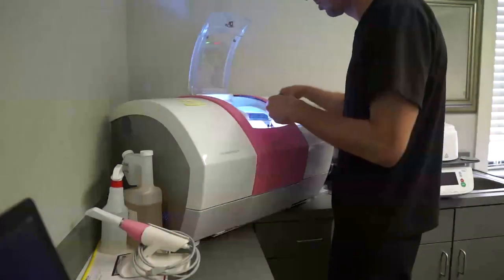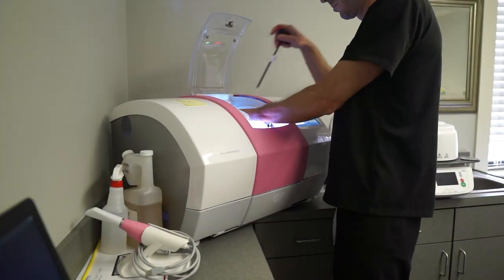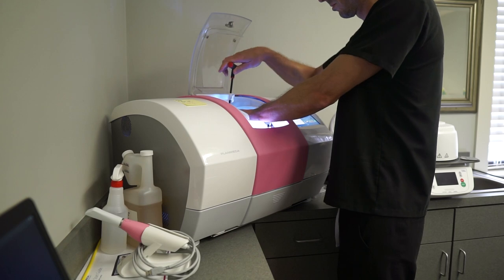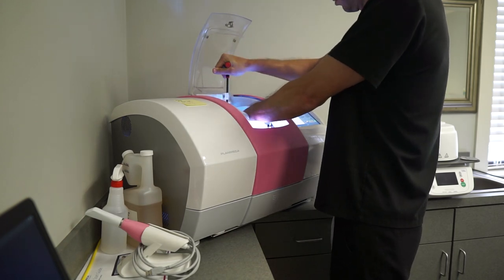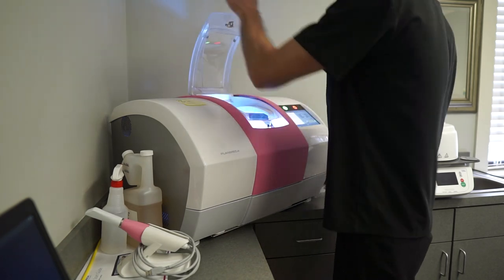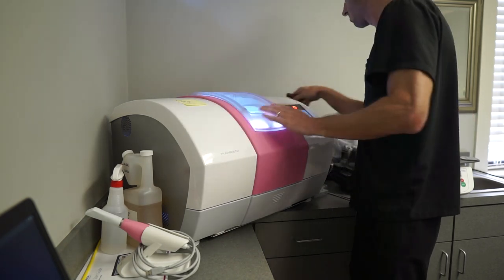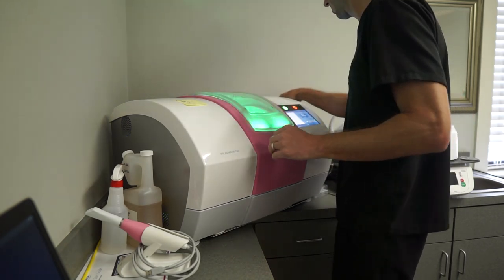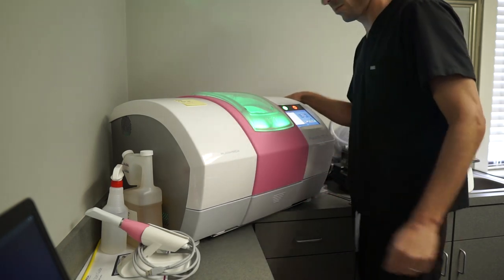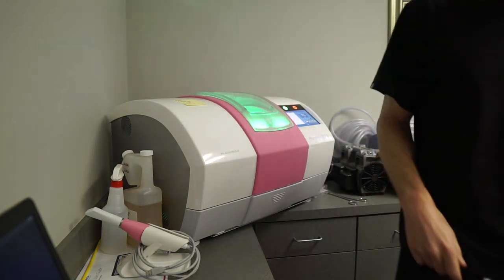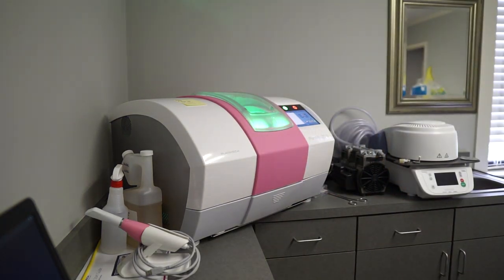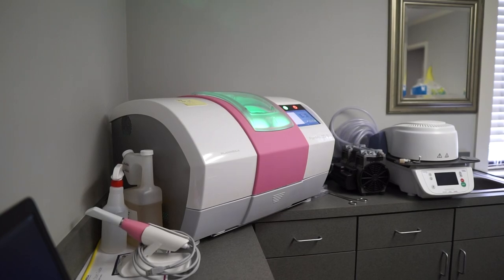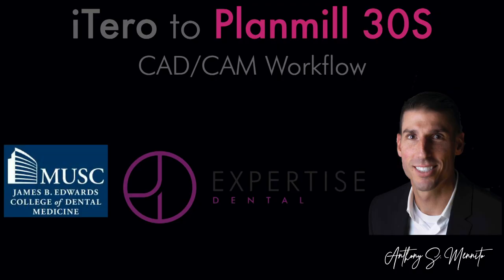And here you are looking at Planmeca's 30S mill. I call it pinky. I really like this mill. So it's a single spindle mill that will give you mill times anywhere from about 9 to 12 minutes, 9 minutes for premolars and 12 for molars. I've been using it for a few years. I really, really like it.